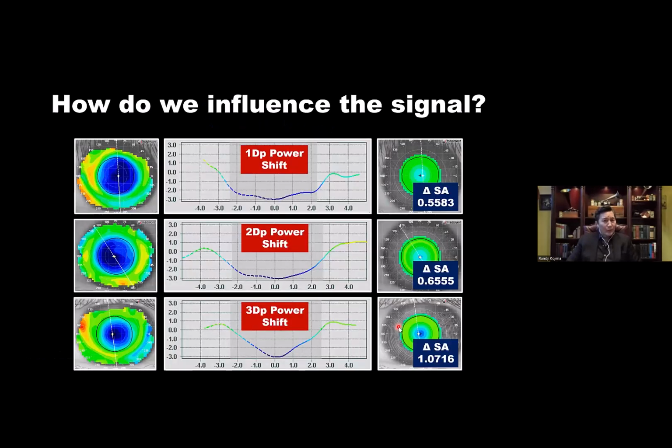So when we do orthokeratology, we don't really know which patients we're going to give a low defocus versus a high defocus to. We don't know which patients will have the low amount of spherical aberration or the high amount of spherical aberration. We do know that the bigger the treatment zone, the lower the defocus, the less the spherical aberration.